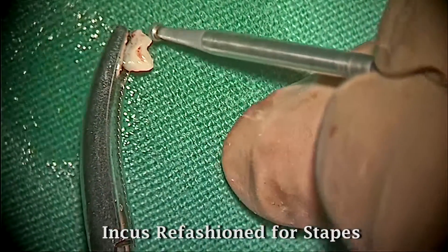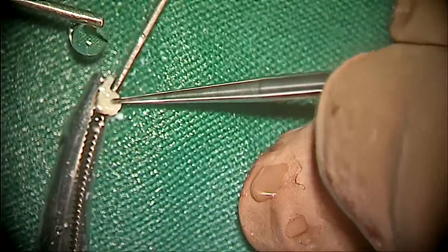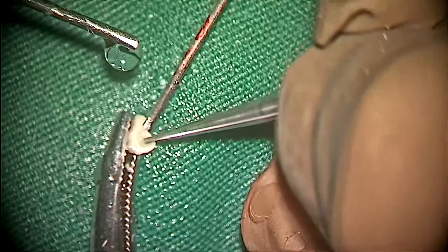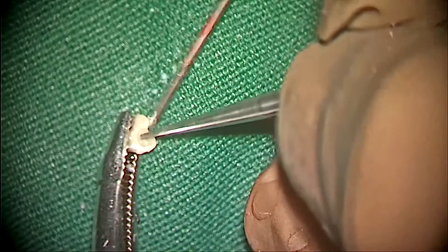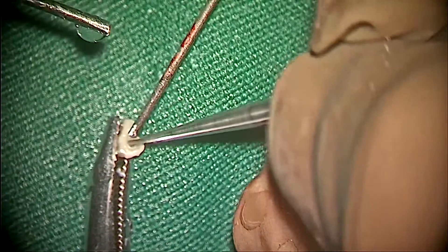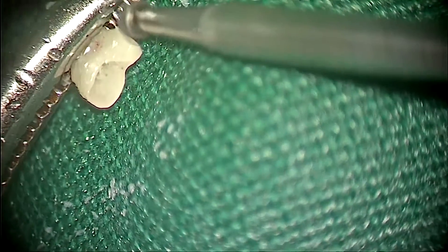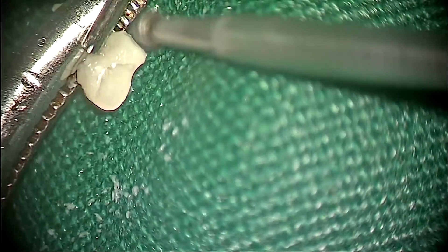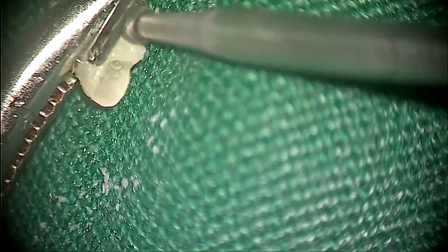The incus was refashioned in such a way that a deep groove was made for the stapes suprastructure, and the other end was shaped for the tympanic membrane. The incus was refashioned to fit like a cap over the stapes suprastructure.